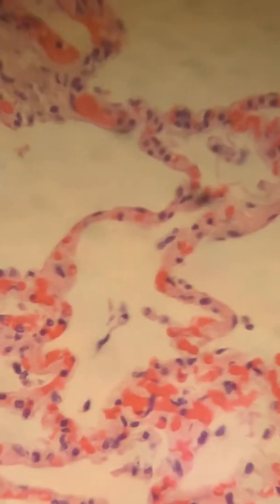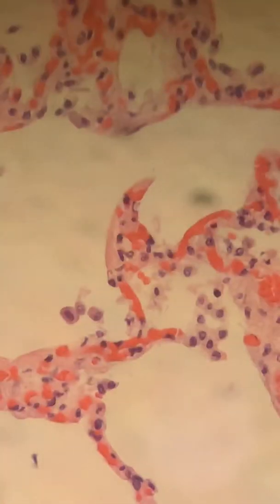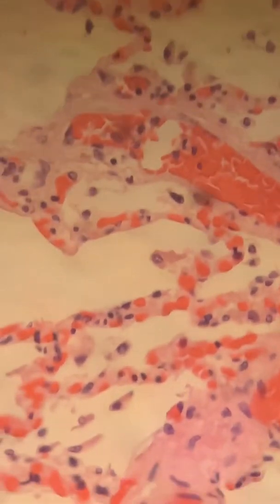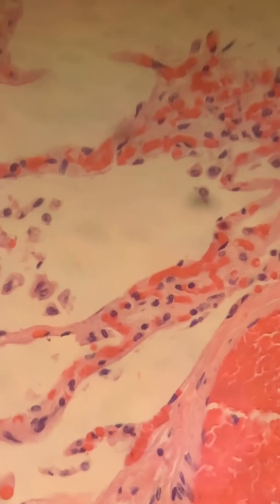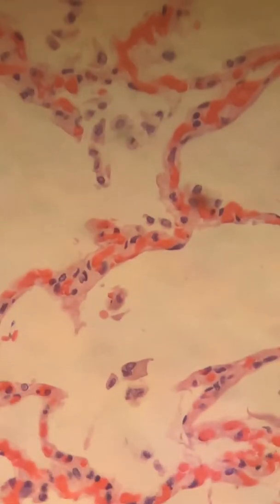As you see here, most of the lungs, the alveolar spaces themselves don't look as bad, but there are other areas that show obviously more inflammation than what we have here. As I continue to scan around on this particular section here, let me just go now to another slide.